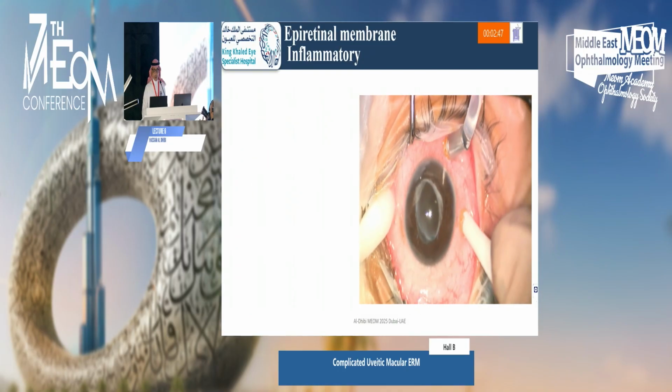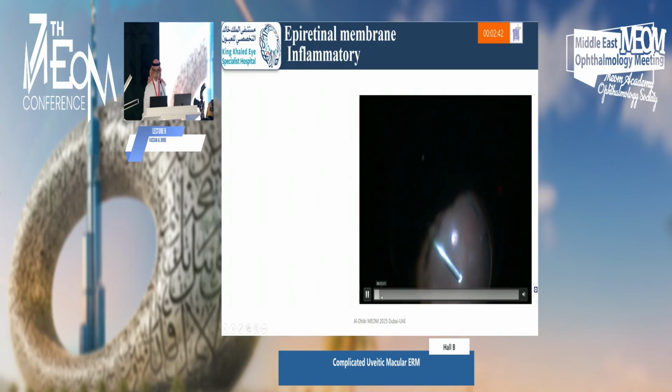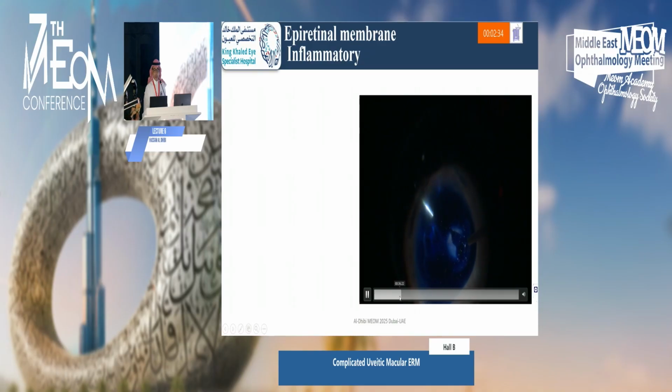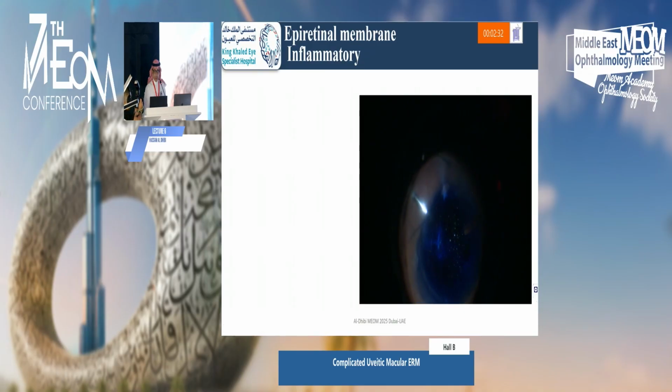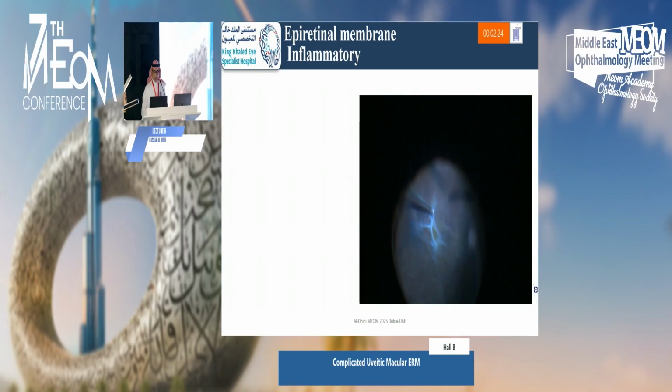She was subjected to vitrectomy, and as you see, I'm sharing this video, enhanced as usual. Getting in with triamcinolone-assisted vitrectomy, then I used brilliant blue to stain the membranes, and then started the game with this membrane. It's not a normal membrane, as you see. Starting to peel with a little bit, some come down. All of the fovea is coming with me. I'm afraid of getting a large macular hole with this peeling.